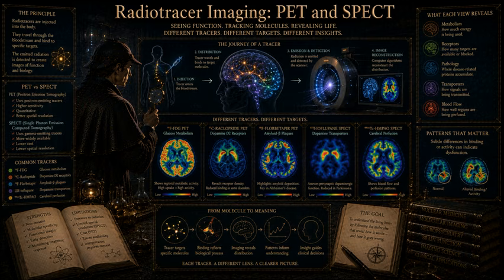If there are subtle systemic differences in how depressed patients metabolize the tracer in their liver or how heavily the tracer binds to blood proteins in their plasma, it can artificially skew the brain measurements entirely. It is a perfect example of how, in radiotracer imaging, your biological conclusions are only ever as strong as the mathematical assumptions underpinning your pharmacokinetic model. It is a debate that likely requires the development of entirely new, more robust 5-HT1A tracers to finally resolve.